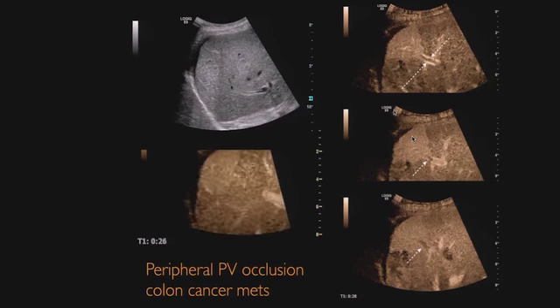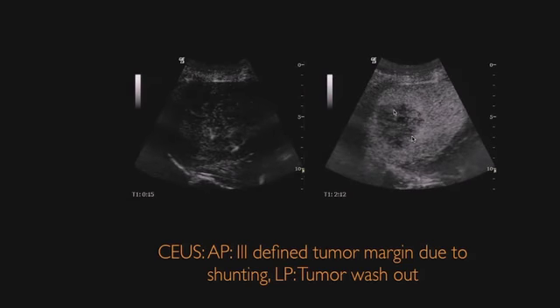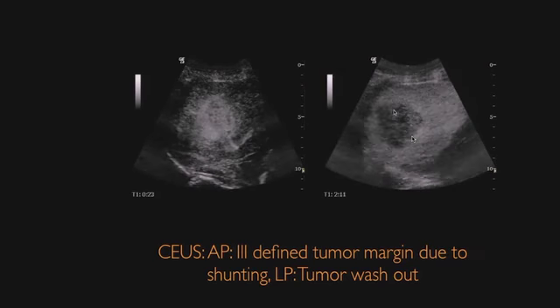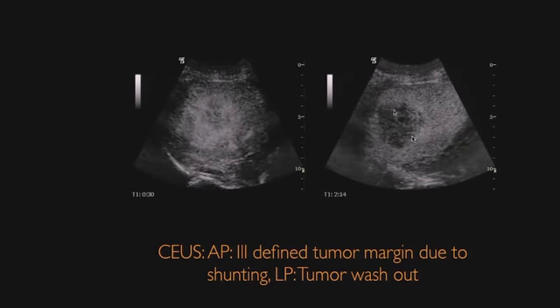This is also a colon cancer metastasis, and you can see it is very highly vascularized already on the color Doppler. And on the left side is the enhancement behavior of the tumor. In the beginning, it starts to be nearly well-defined, but then it's fading away. The contrast is enhancing the area around the tumor. And on the right side, you can see the tumor is now washed out.